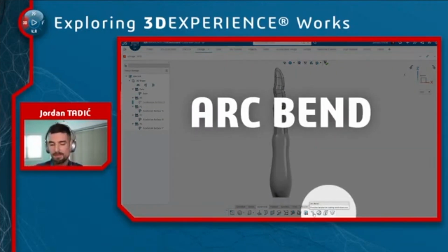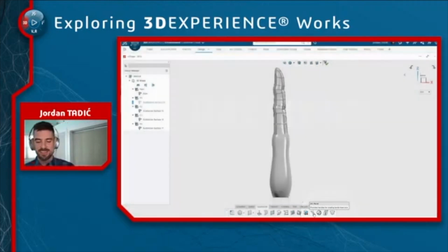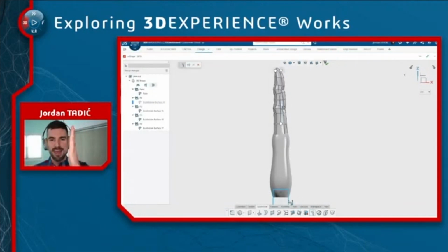All right. The final thing that I want to show here is the arc bend. This might be the most fun tool to use on the platform. So what it does is, if you notice, no one's hand at rest is perfectly flat. It's always kind of curved a little bit. And that's what we want to do here.